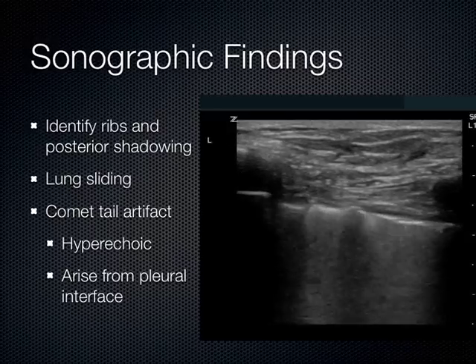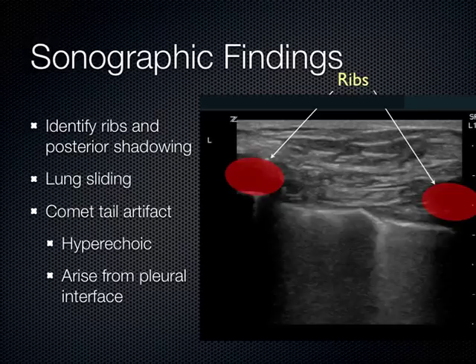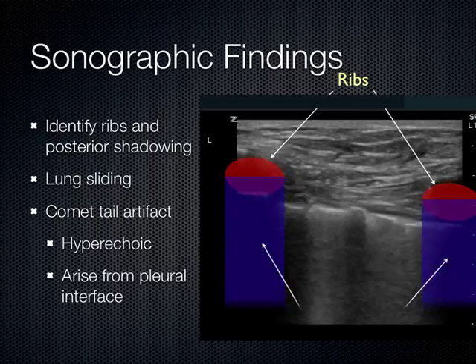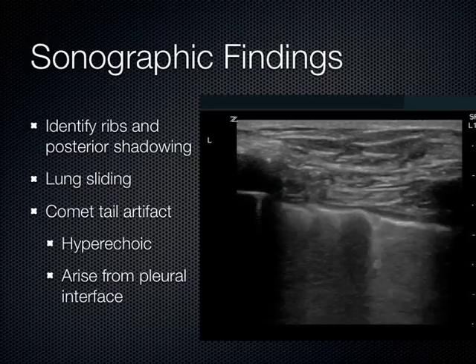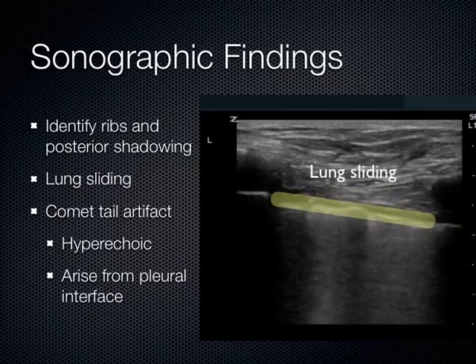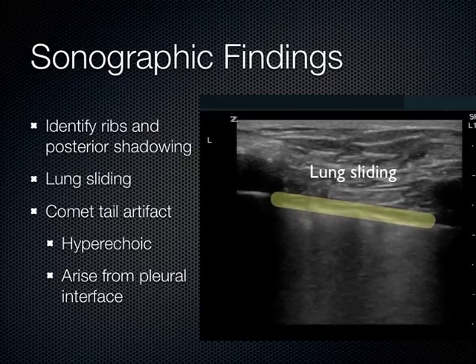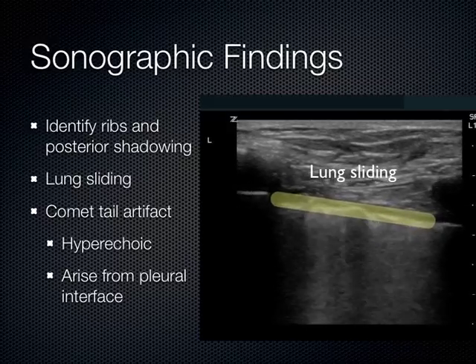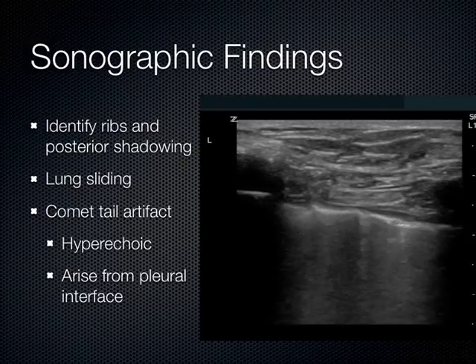And again, just in case we're not talking the same language, this is lung sliding with some B lines underneath. This means that your lung is up. It's basically the visceral and parietal pleura are touching each other, and you don't have a pneumothorax in that area where you're looking. Doesn't mean you don't have a pneumothorax somewhere else. You still have to be thorough and look in all the 8 quadrants, but it means at the place where you're looking, the lung is adhered to the chest wall.